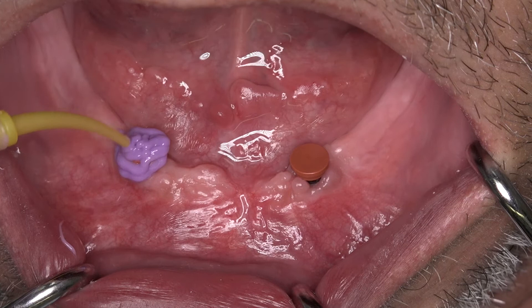The angulation option has been very helpful to align implants that I've inherited from previous treatment and bring them all into line, and that does make the prosthesis work better. I think it probably broadens the scope of what you can do with a stud attachment. The aesthetic option definitely works well too — there are some nice new features.